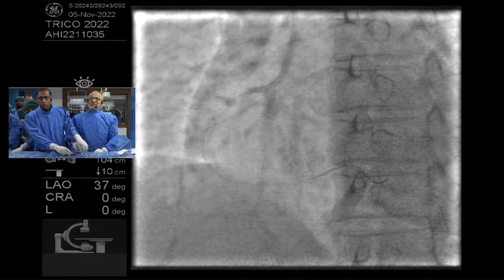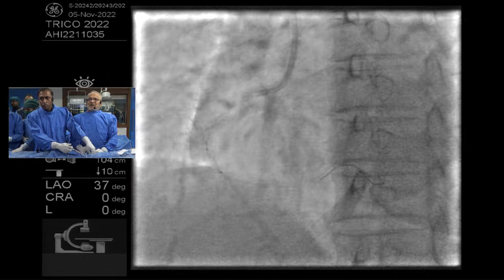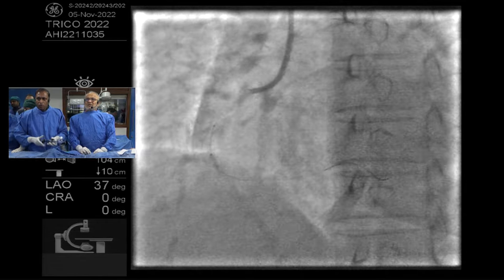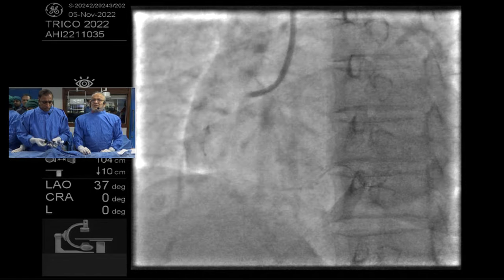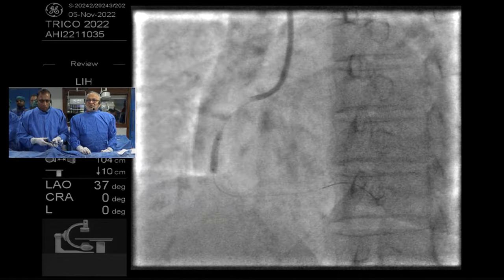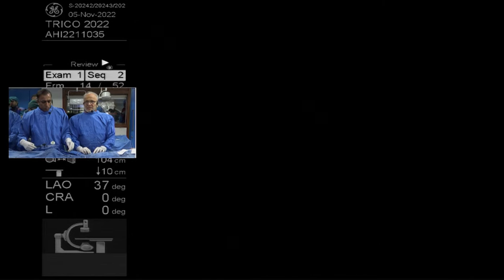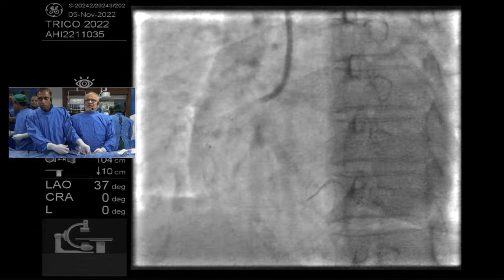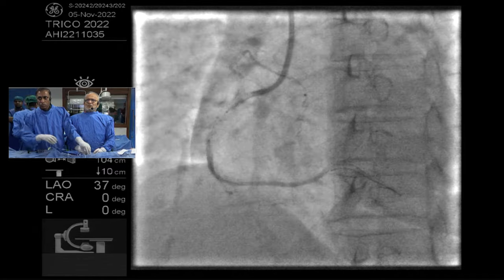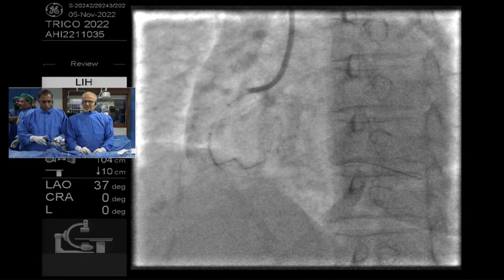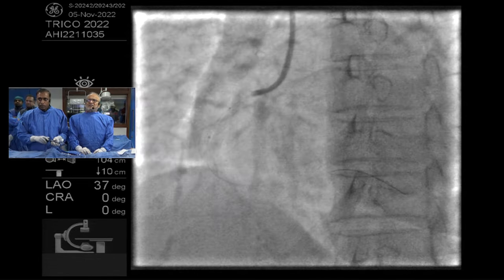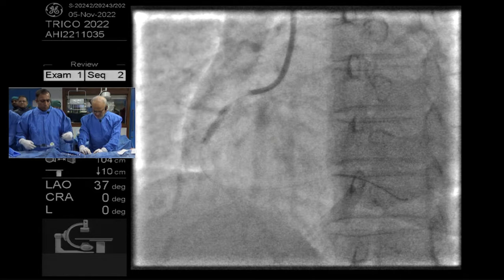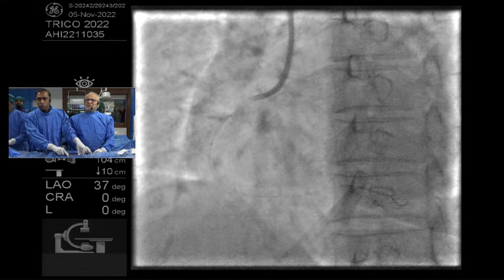The lesion is tight. The balloon is not slipping much, which means it's not very old — April 2022. Inflating: going up 6, 8, 10, 12... deflating. The balloon is out.